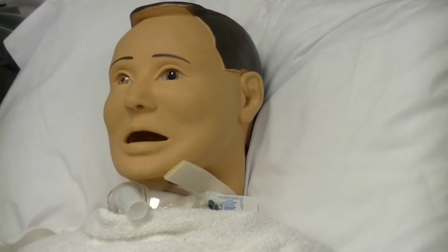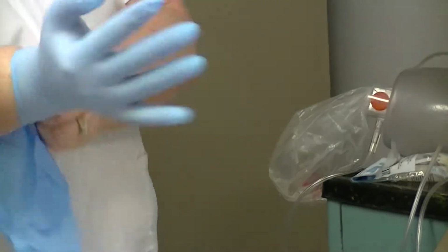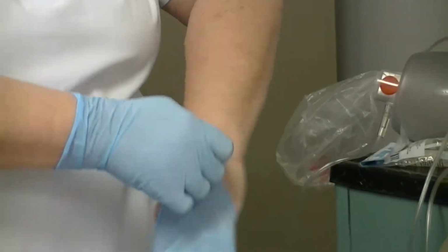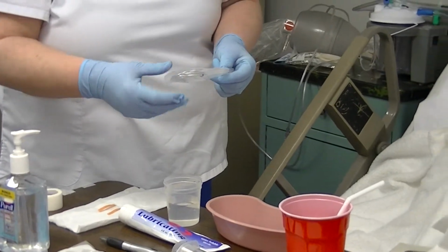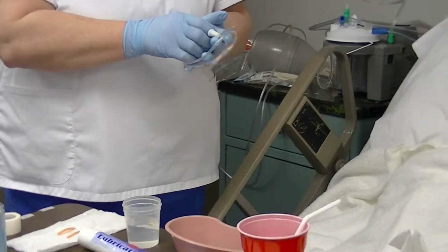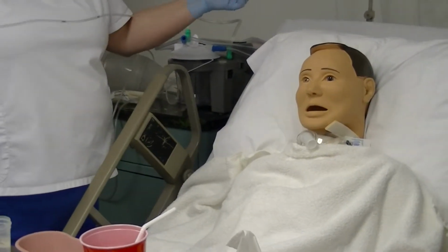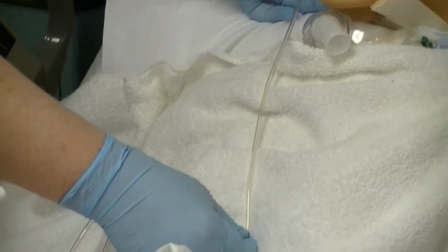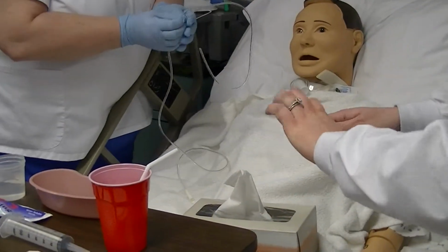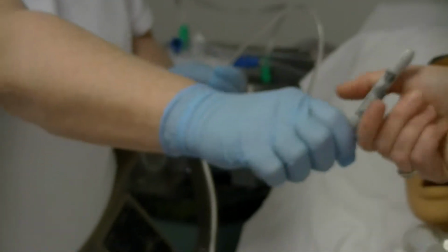All right, the next step is to don your gloves and unwrap and uncoil your tube. The next step is going to be to measure the patient's tube length, which is the nose to the earlobe to the xiphoid process. You can either tape this end here, but we are going to use a marker to show our stopping point.